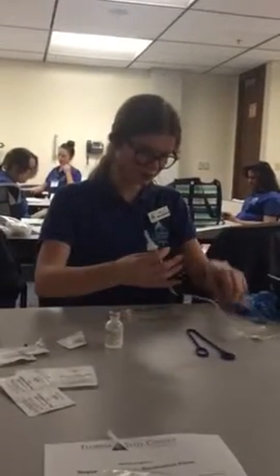And on the medication label, you have the client's name, the drug, the dose, the time, the frequency of the drug, and your initials. You also want to calculate the drop rate and the flow rate. So once you have your drugs all calculated, you then can go ahead and prime your tubing.